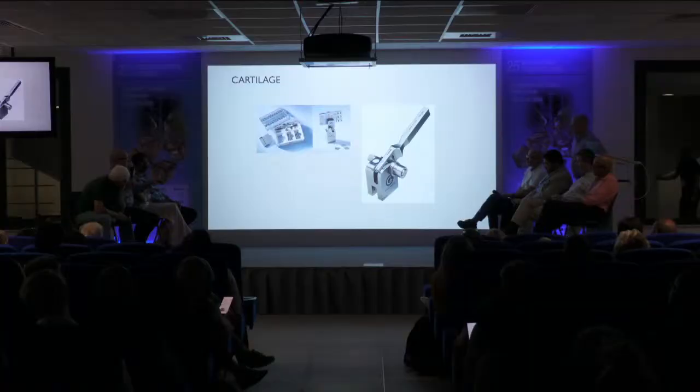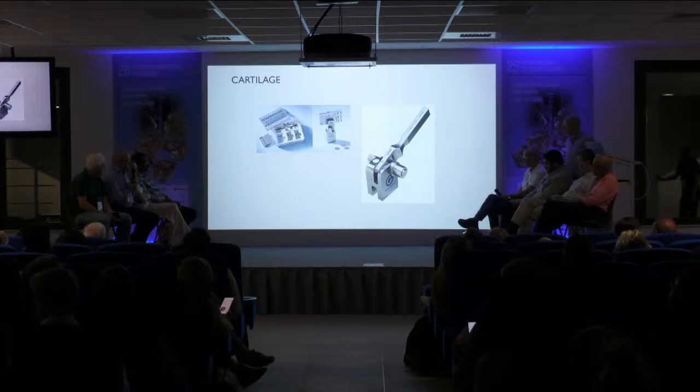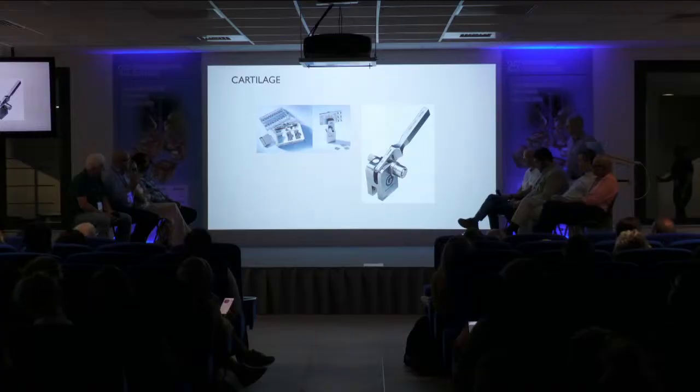Chris, I implemented my database 20 years ago, so I have a long follow-up, and I was extremely surprised to see that when there is cartilage reconstruction for the tympanic membrane, the extrusion rate is 1%. It's low. Very little. And that's with titanium, generally.